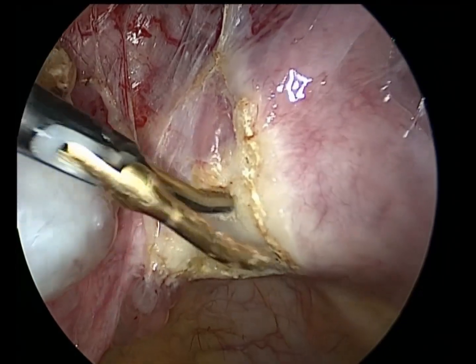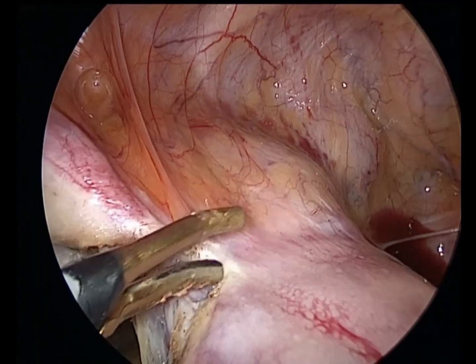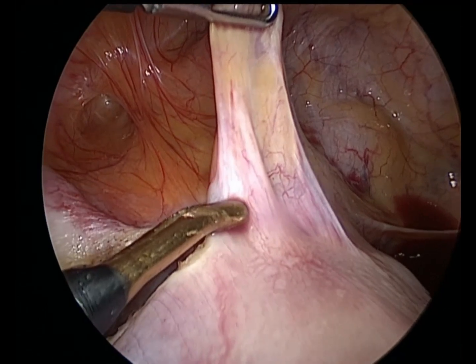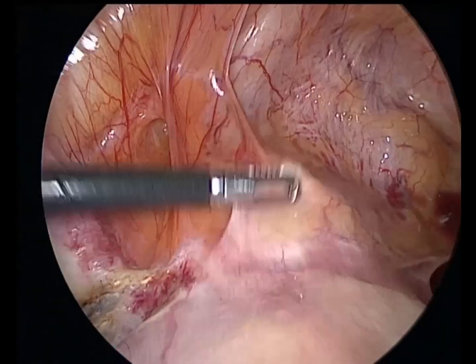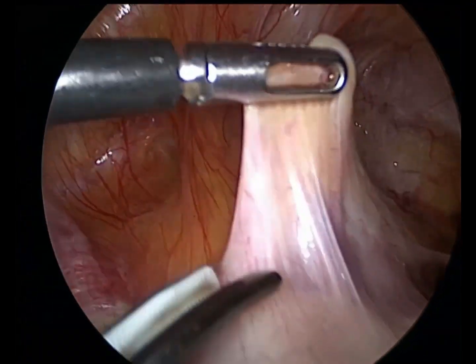Now we are coming to the separation of the bladder. The only trick is to stay very close to the cervix, and there should be no yellow with the uterus. All yellow goes with the bladder.